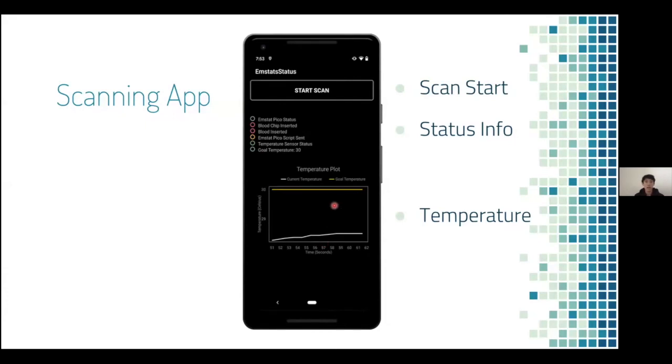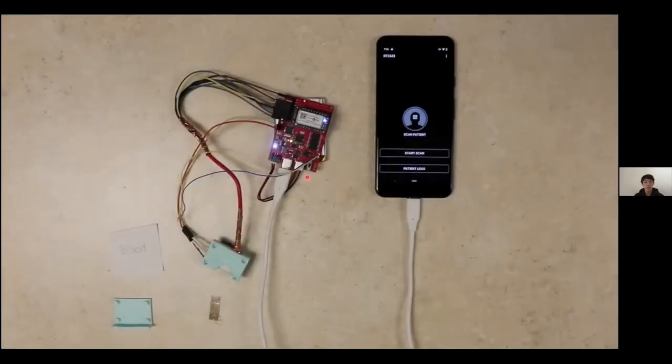Here is our scanning application. In this application, we can start the scan by clicking the button, and we can see the status here. We can also see the temperature by the temperature plot. And you can see the whole process of the app in the demo video. Here is our demo video.